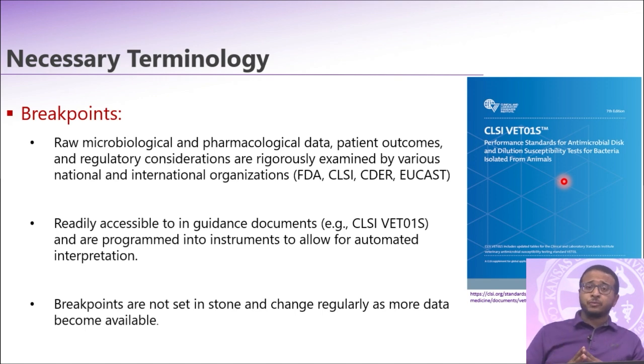They are subject to evaluation once more data become available to us, right? That's why we need to revise them constantly and in a regular way. And some of the reasons that these breakpoints get reviewed is if a laboratory technique gets optimized, which will affect the breakpoint, then we need to look into these breakpoints again. If a new or novel resistance mechanism has been identified in a certain group of bacteria and affects the breakpoints to some antimicrobials.